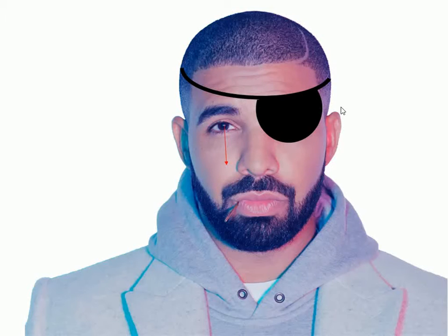Again, he's looking straight ahead, and we're going to place the ball behind his head and move it forward and see at what point he's able to detect it. So it's coming from behind, and more or less when it's exactly to his side, he picks up and notices that the ball is there in his visual field, even though he's not looking at it. He's picking it up in his peripheral vision. This would correlate to about 100 degrees. Hopefully we are all familiar with what a 90-degree angle is, and here you can see slightly beyond a 90-degree angle, slightly backward even. So that would be 100 degrees.